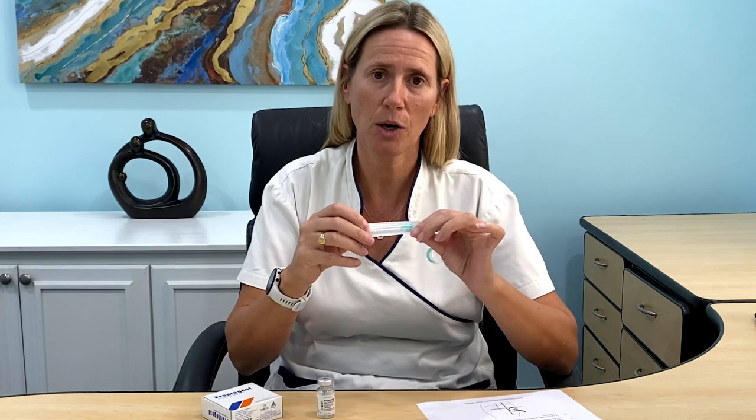You will need a 3ml syringe, a long green needle and a thinner bore needle for the injection — this is still an inch to an inch and a half because it needs to go into the muscle. You also need your alcohol wipe.